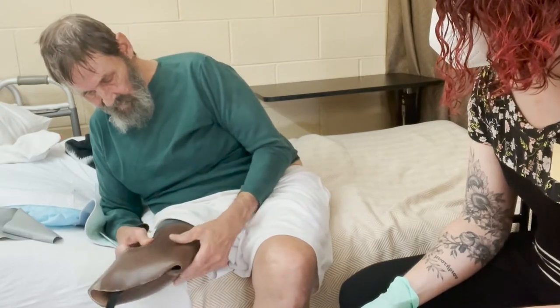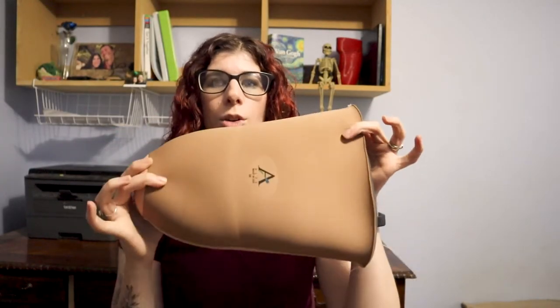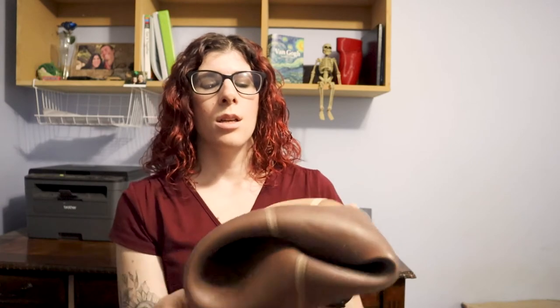When taking the liner off, the exact same thing applies — you want to roll the liner down, not pull. When you're all done with the liner, please remember to keep it right-side out. I'll often come in and find the liner left inside out, which is going to cause cracking in that area. The liner will also collect dirt, dust, animal hair, and whatever else is floating around, wearing it out much faster.